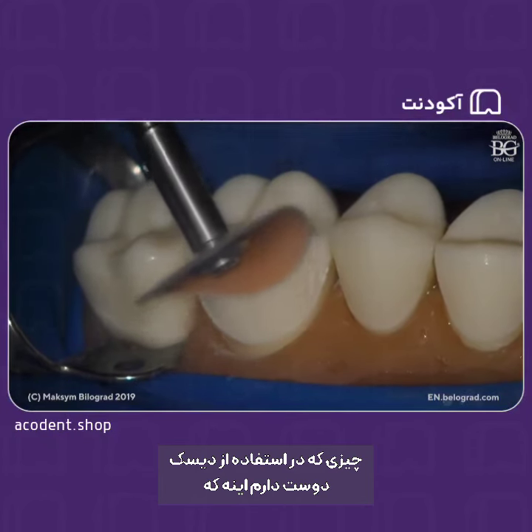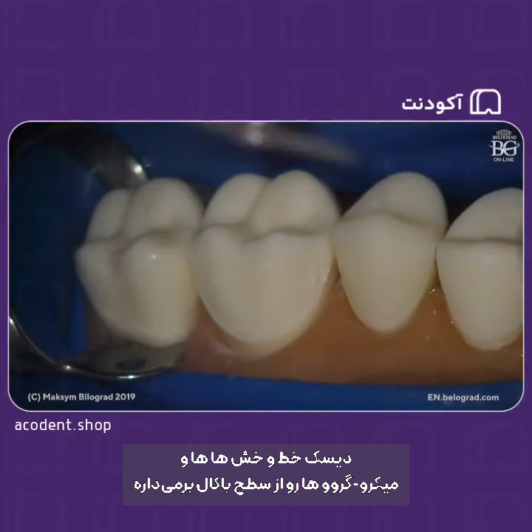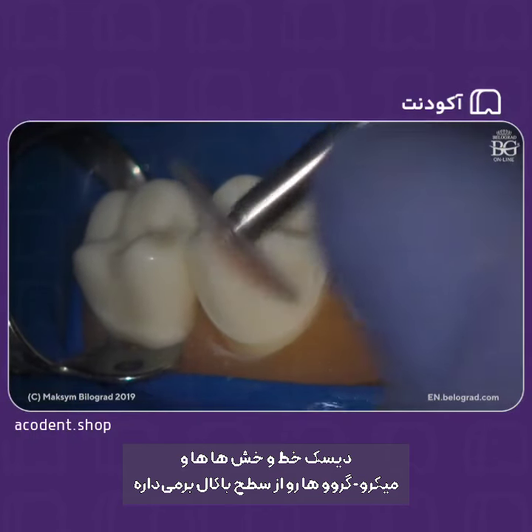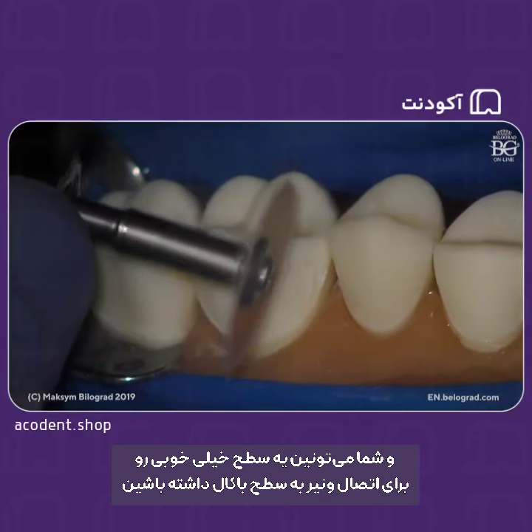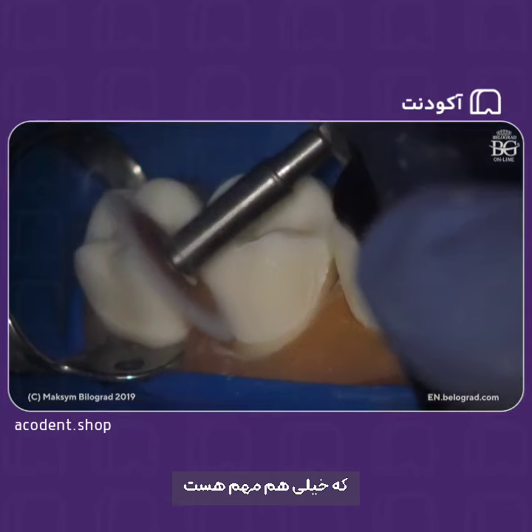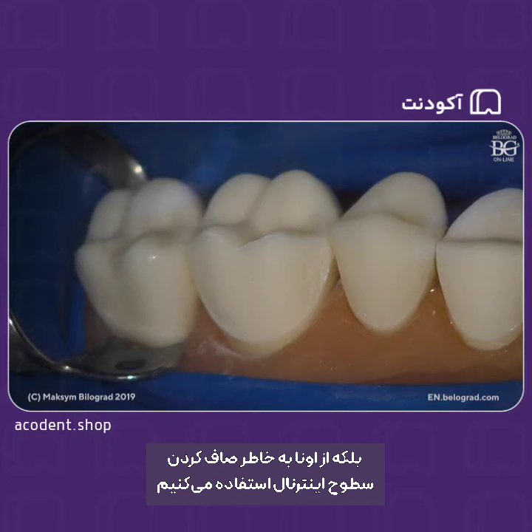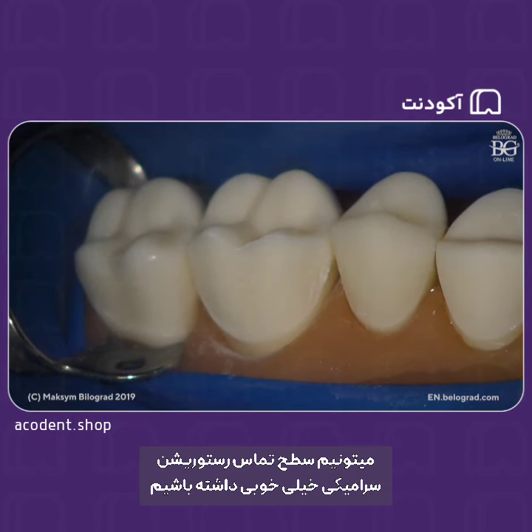And you know what I really like about working with discs is that disc removes scratches and some small micro grooves from buccal surface, and you can expect a really good surface fit of your ceramic veneer to the surface of the tooth. Okay, this is important. So basically, we are not using discs for polishing. We just make really smooth internal surface.